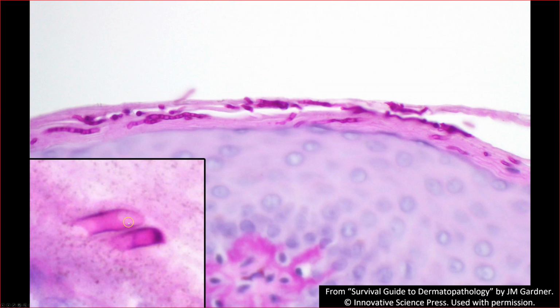And then here's a real close-up view where you can see, if you're not sure, sometimes you see PAS positive stuff in the stratum corneum because serum will be PAS positive. The key to me is seeing either a cross-section round tube or an elongated hypha that has either little septations in it, or that you can see there's a clear hollow center with a thick pink on the outside. And they're very uniform in shape, in diameter. They're very constant in their shape. I find that helpful because sometimes I see pink stuff and I'm like, is that real or not? And you've got to decide.